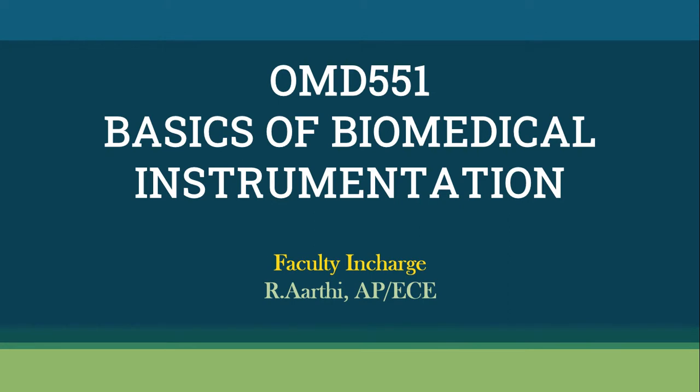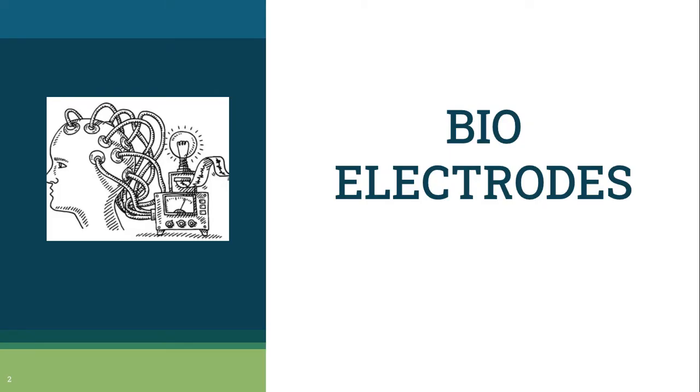Hello everyone. In this video we are going to discuss the basics of biomedical instrumentation. So in this we are going to discuss bioelectrodes. Bioelectrodes are nothing but an interface which acts between the human body and the electronic system.